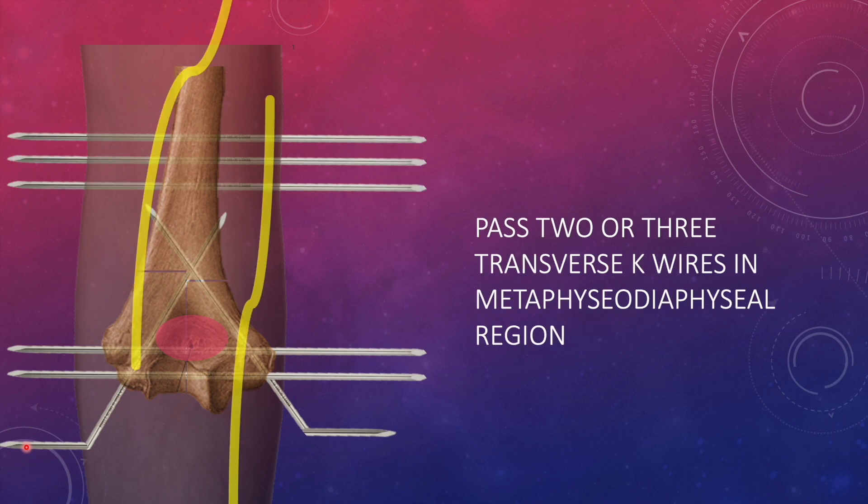Now you have to create a diaphyseal assembly. Again, be careful you have to pass the wires through the skin cover then enter into the diaphysis. You have to avoid any injury to the ulnar nerve and radial nerve. It won't be problematic because everything will be done under direct vision. The radial nerve would have already entered into the anterior compartment and it won't be visible posteriorly in the lower part.